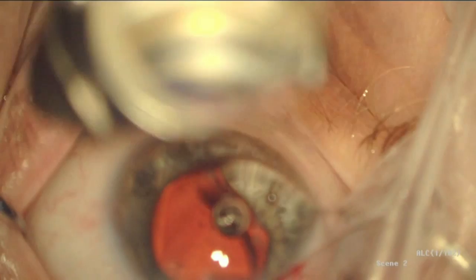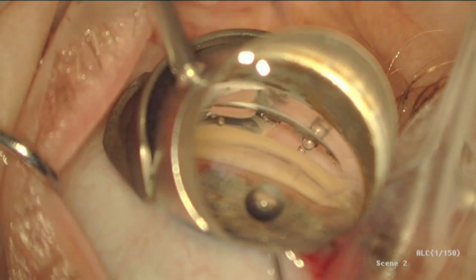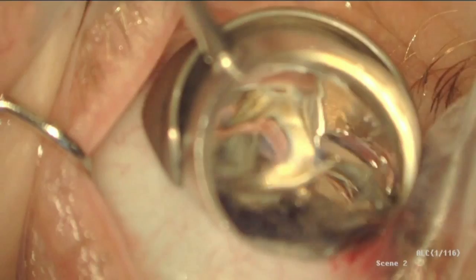The removable ring is designed to offer flexibility for use on the Ocular Instruments Ocular Hill & Swan Jacob Gonio lens, and allows the surgeon to add fixation whenever necessary to facilitate management of the eye.